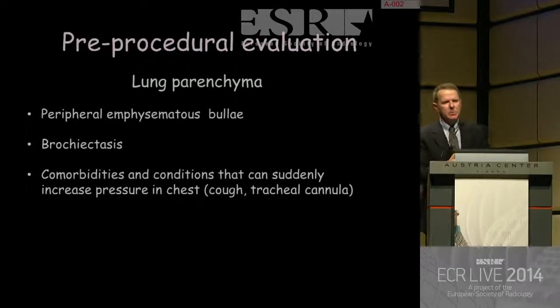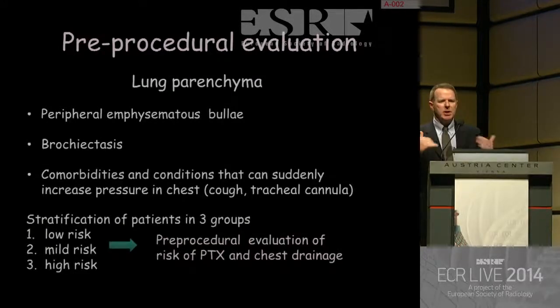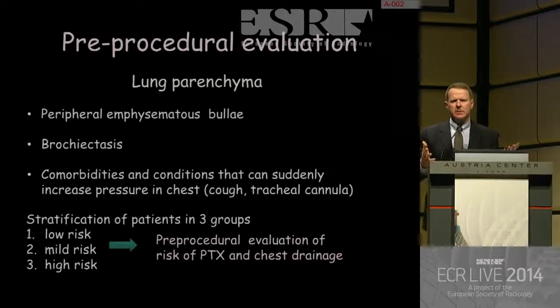So we try sometimes to sort, this is not scientific, something that we do in our practice. We try to study the lung parenchyma looking for bulla in the needle tract, not just generically COPD, but bulla in the needle tract, presence of bronchiectasis, comorbidities and other conditions, and we try to stratify the patient as a low risk or zero risk, can be done in daycare. Mild risk can be done in daycare if an experienced person does it or if there are other needs, and high risk where I do prefer admitting the patient to the hospital.